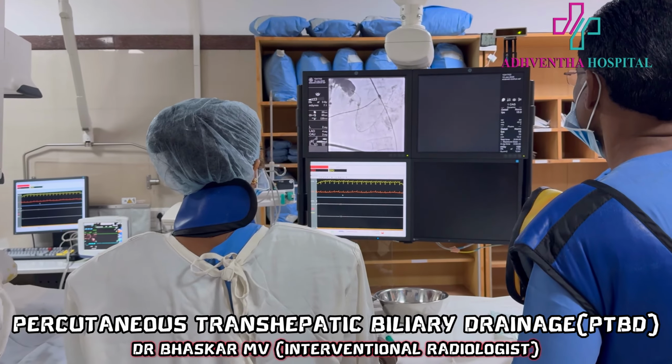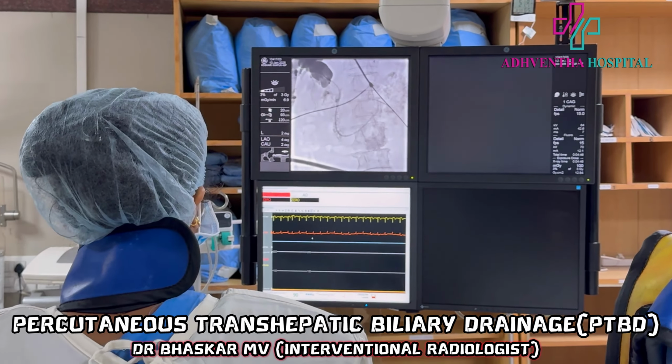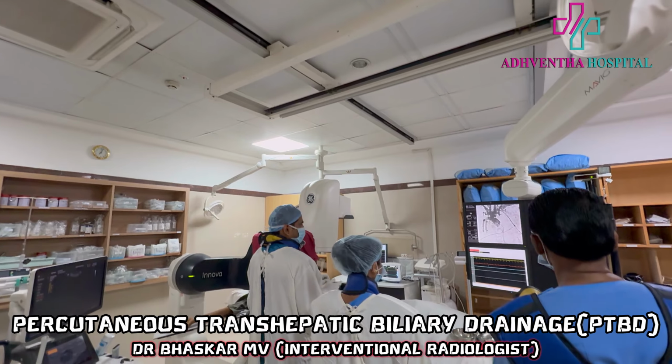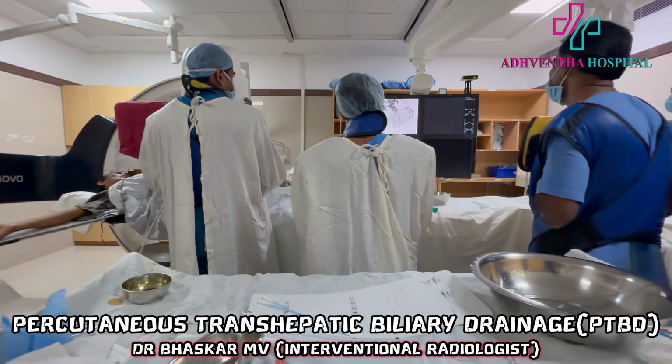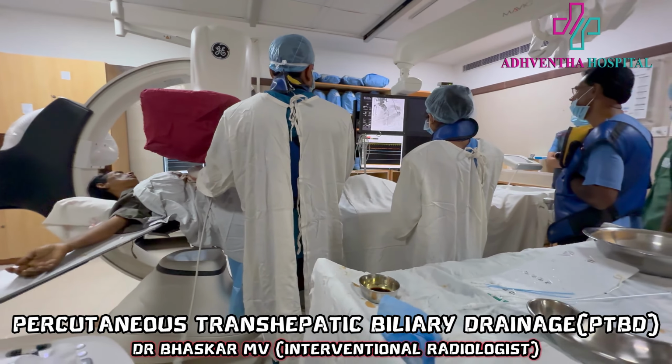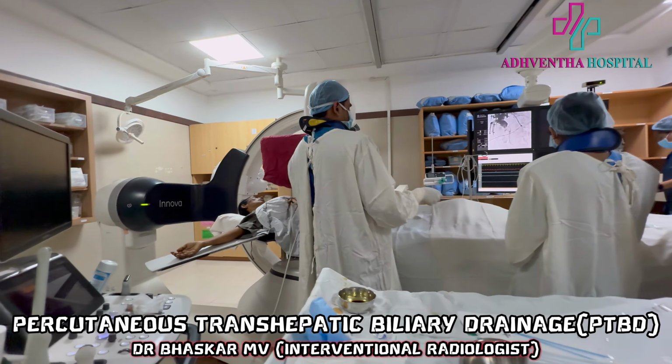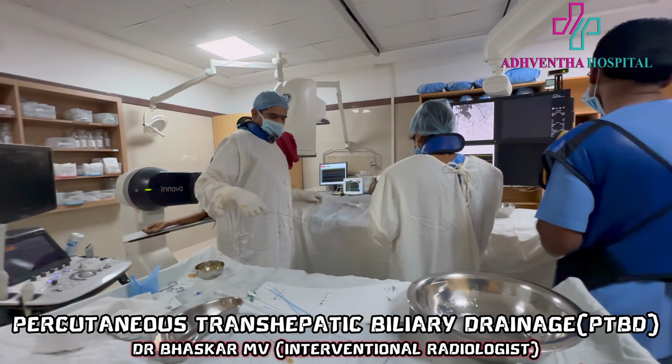The problem is exchange length, is there a stiff one? Show up, show up. But how to exchange? I want exchange. That's okay, we'll see later.